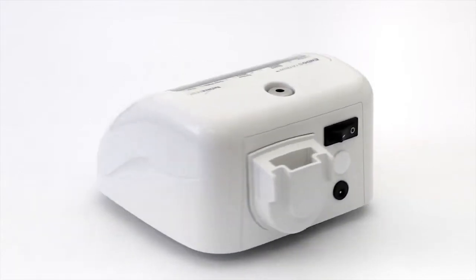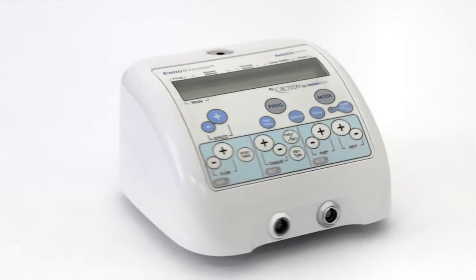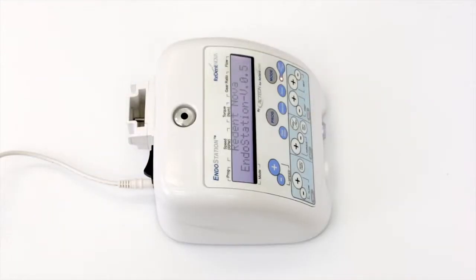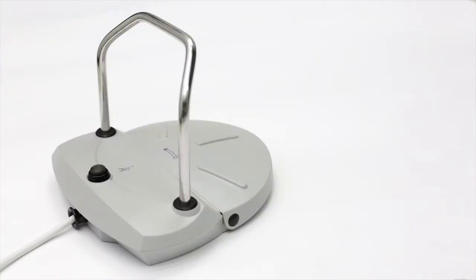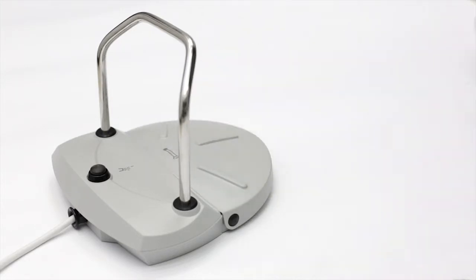It is combined with a built-in irrigation system, providing constant low-volume irrigation during endodontic treatment. Plug in the power transformer, connect it to the endo station, and switch it on. The endo station has an E-type micromotor compatible with various contra-angle handpieces, and is operated by a footswitch that controls the endo motor and the irrigation pump simultaneously.